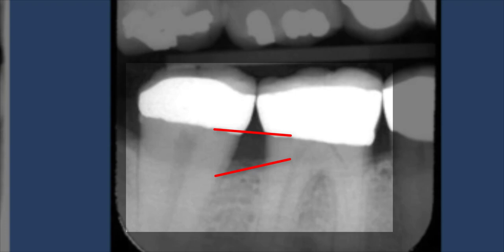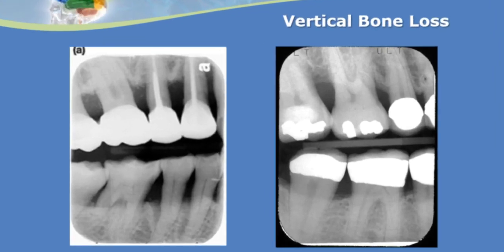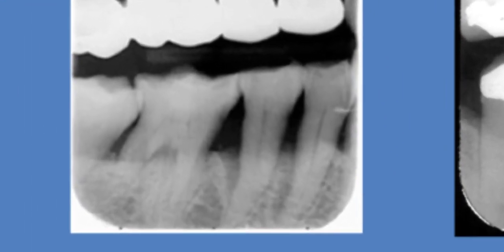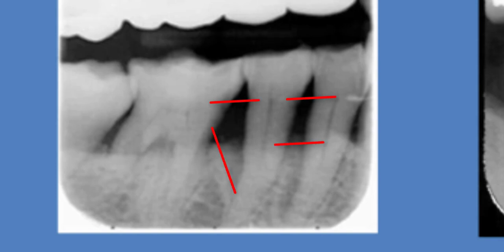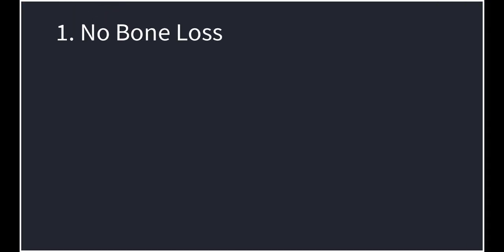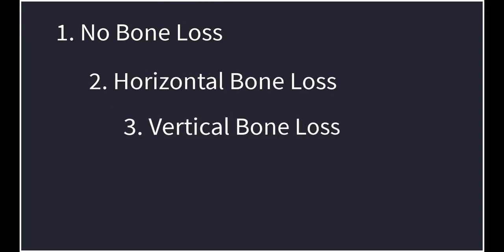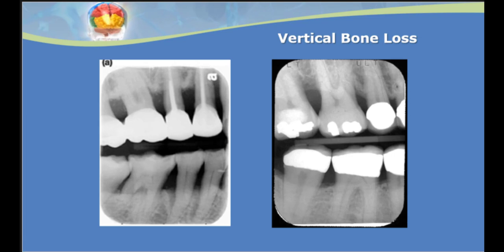Number 31 has vertical bone loss on the mesial. Is it possible to have both vertical and horizontal bone loss on the same tooth? Looking back at number 29 and evaluating its mesial — yes, a tooth can have both. There are four choices when evaluating bone loss: no bone loss, horizontal bone loss, vertical bone loss, or both horizontal and vertical bone loss. It's important to evaluate each tooth on both the mesial and distal when assessing bone loss.